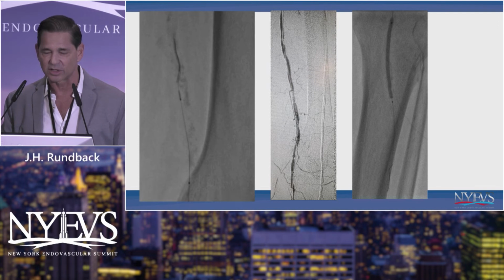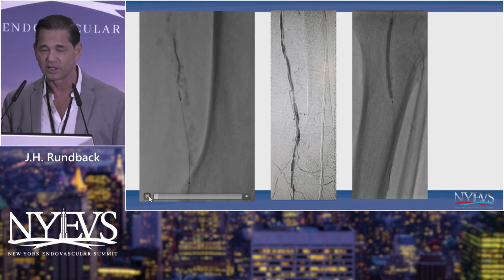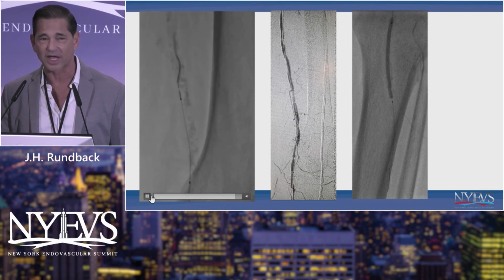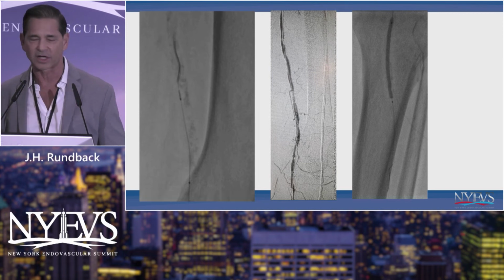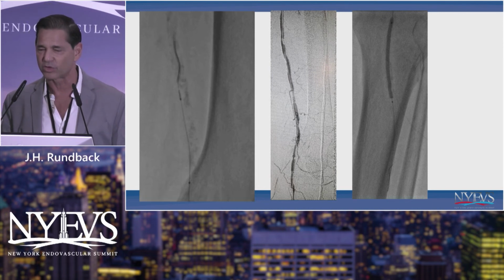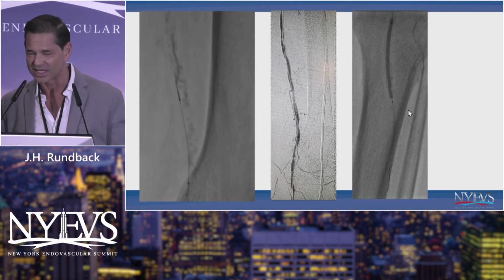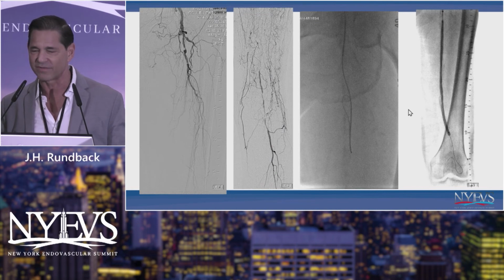In this case, this is that obligatory slide. This is all commonplace to this group of operators, but certainly for those people who haven't done this, it is an 035 catheter from the top and an 014 retrograde wire. Both need to be angled so you can deflect off the wall, and then you capture this with through-and-through access, and then you're going to go ahead and complete your case, however you might like to complete the case once you've gotten recanalization, so you can then proceed with revascularization.